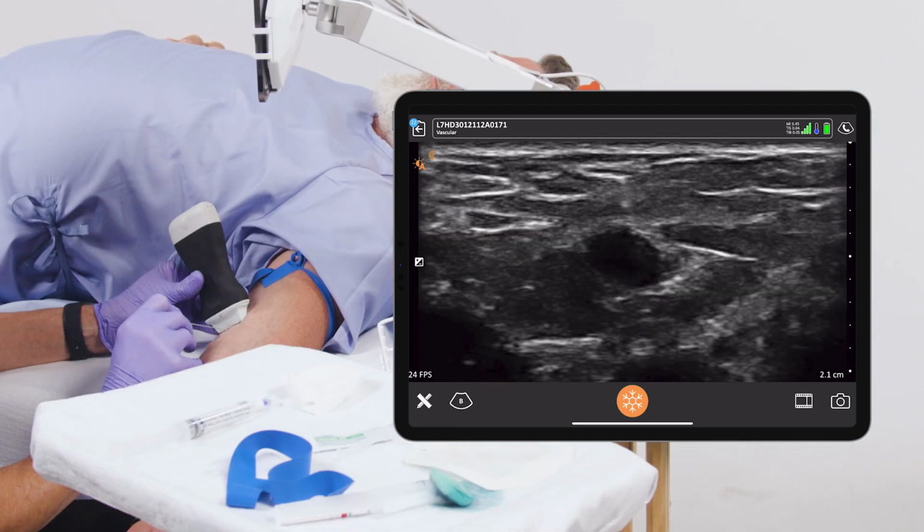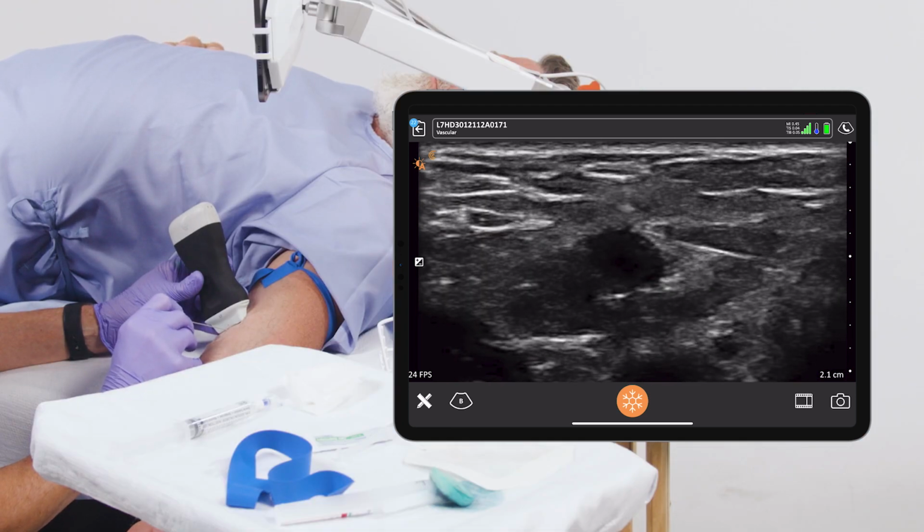Well, you can imagine these patients, it's tough. They just don't have vascular access. And so having the ability to do that at the bedside using ultrasound, it's not just a safety factor, but it's the ability to actually get intravenous access. It's getting the procedure done.